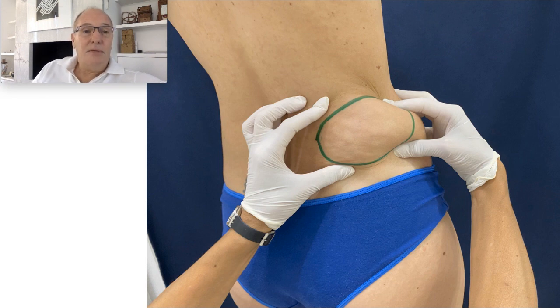The advantages of my technique are almost no scar, I can perform it under local anesthesia, it is ambulatory, almost no downtime, only need the patient compression in this area, and there is low probability of infection, hematoma, or seroma. I make an ability to remove the full lipoma through this incision — I make like a spear, and I remove it like a delivery. I call it the delivery of the lipoma.